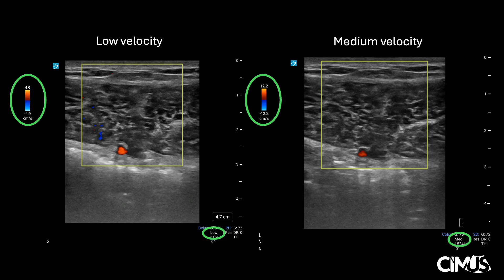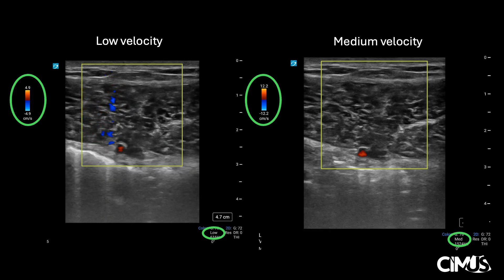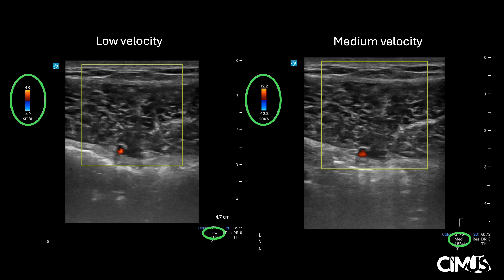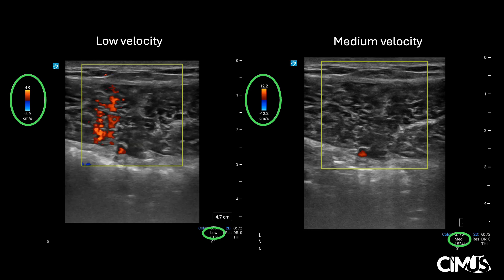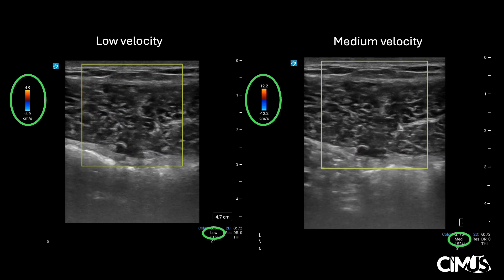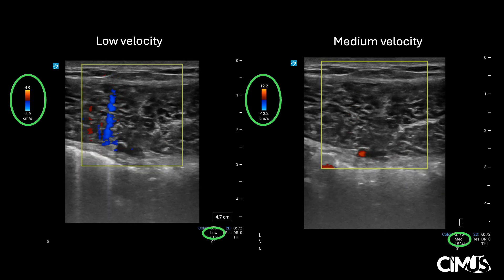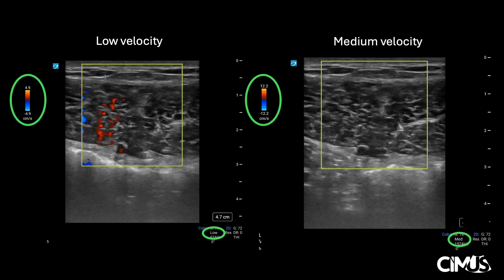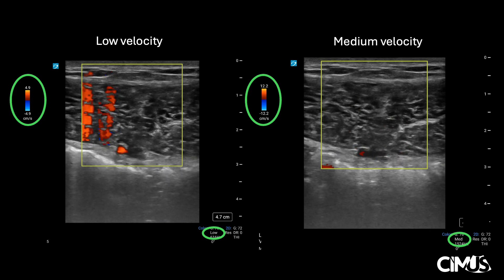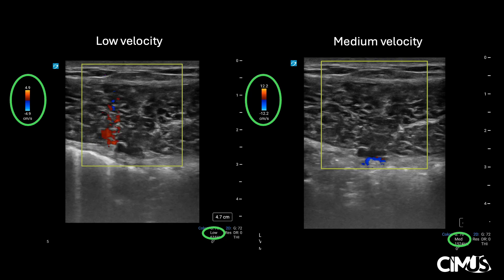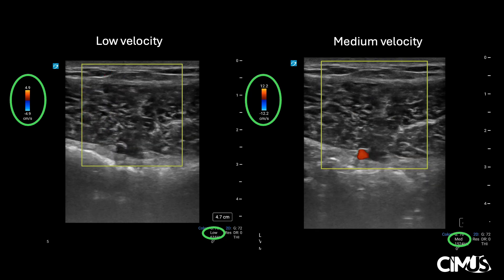Here on the left, the scale is on low-flow settings — we can see both arterial and venous flow. However, there is more flash artifact, which can potentially obscure other vessels. On the right, the scale is now set on medium-flow setting. As you can see, venous flow is now missed, but there is no flash artifact seen. For the purposes of assessing for vessels pre-procedure, the flow should be set as low as possible to avoid missing low-flow vessels.